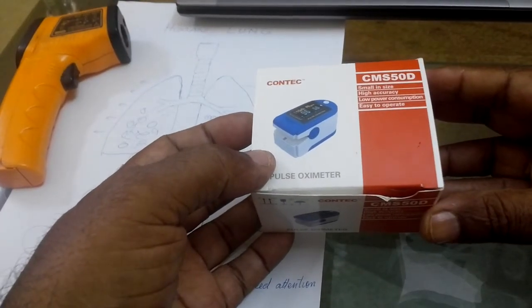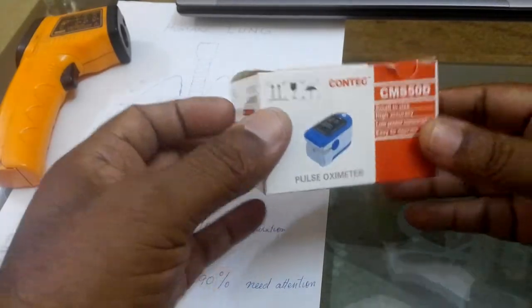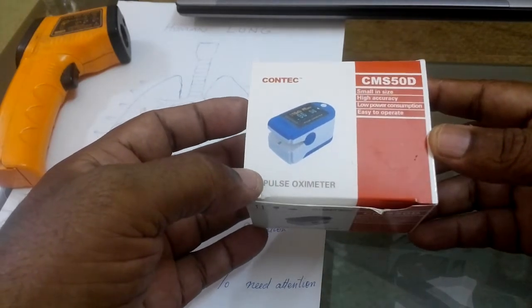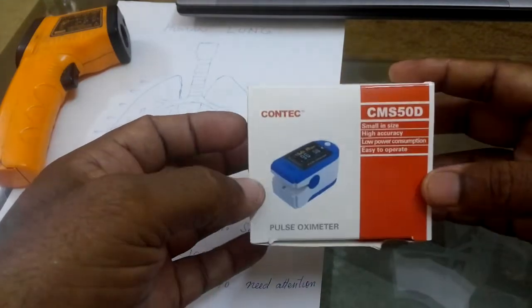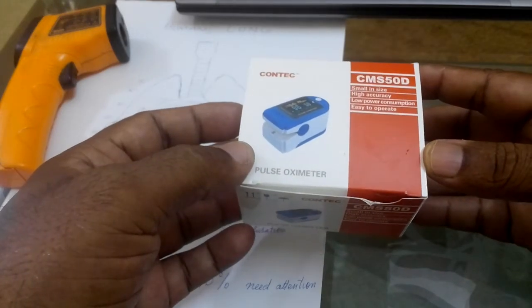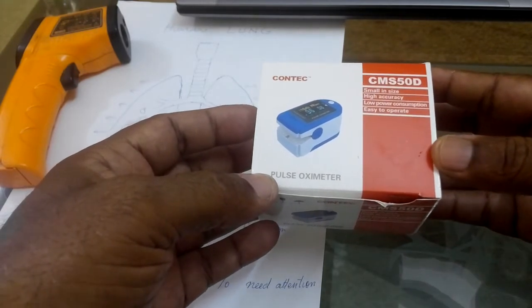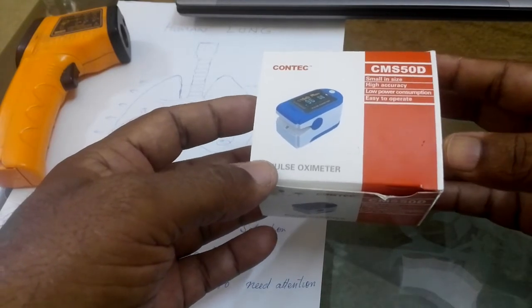Hello viewers. Nowadays in the market, many different types of pulse oximeters are available in different packings, different colors, and different shapes. Many people are buying them and many online companies are selling pulse oximeters — most are manufactured in China. So how do we make sure that your pulse oximeter is working correctly and can accurately measure blood oxygen level? Let's check how to test whether your pulse oximeter is working properly.